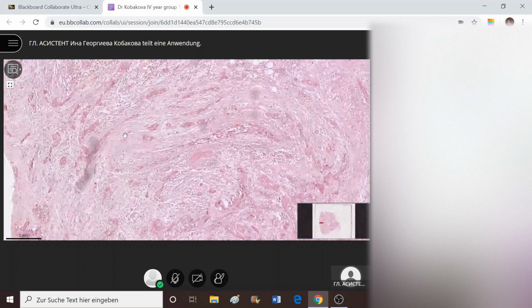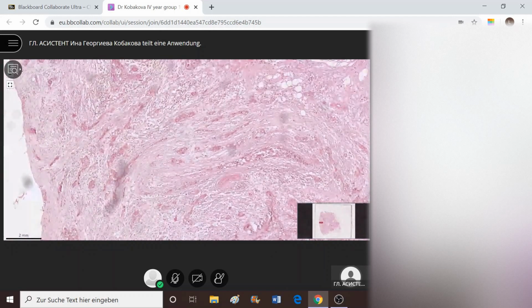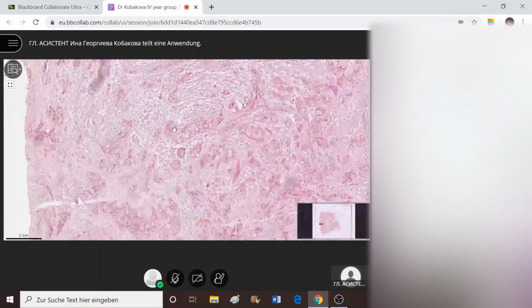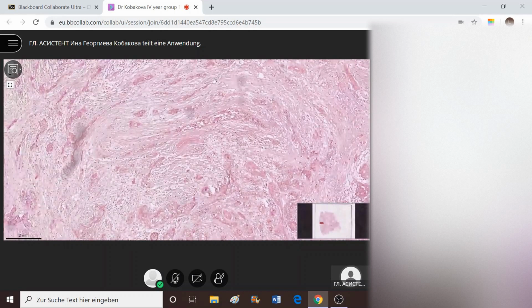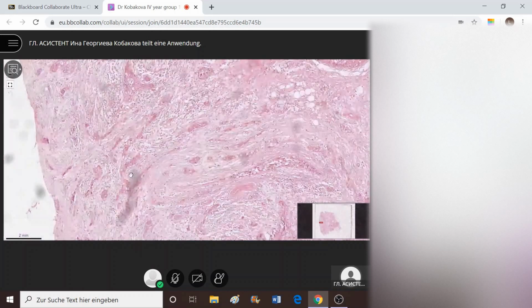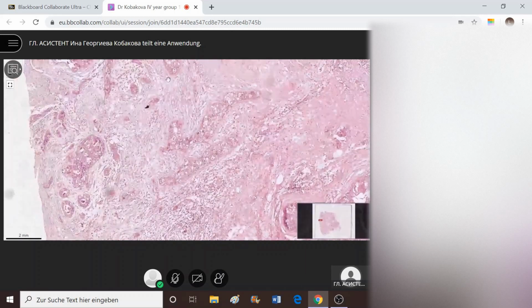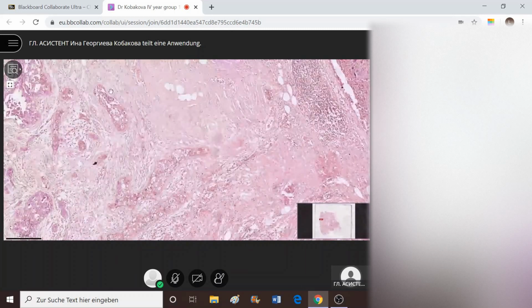So I do not know who wrote this one to be infiltrative ductal breast carcinoma, because they did not perform, or perhaps they performed immunohistochemistry, and this showed them there is actually preserved adhesion in between the cells, and they're staying in packages together. But if it's by this picture only in hematoxylin eosin, my suggestion would be mixed type, lobular ductal.